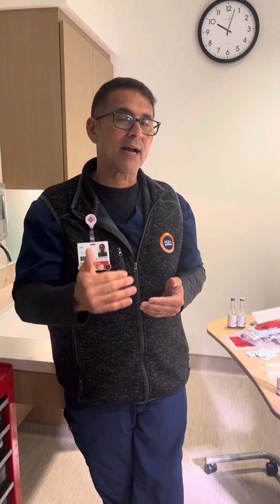You should not be drawing blood cultures when you start an IV. I know it's done every day. I know it's done in the ER. And there may be a circumstance where I might say, you know what, this kid's been poked 20 times and I have to get an IV and I have to get a blood culture, and that's okay. But don't make it your practice to do that because it does raise your contamination rate.